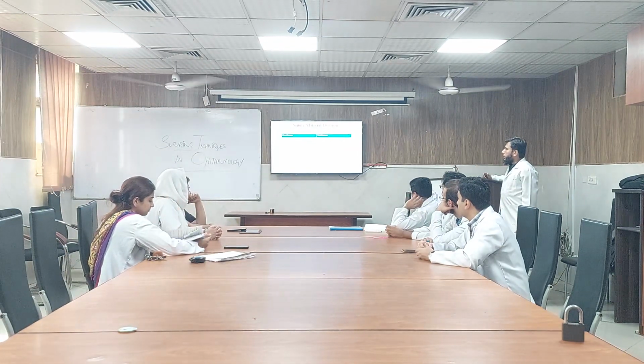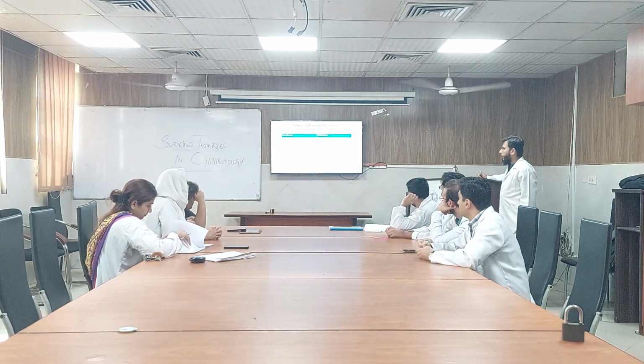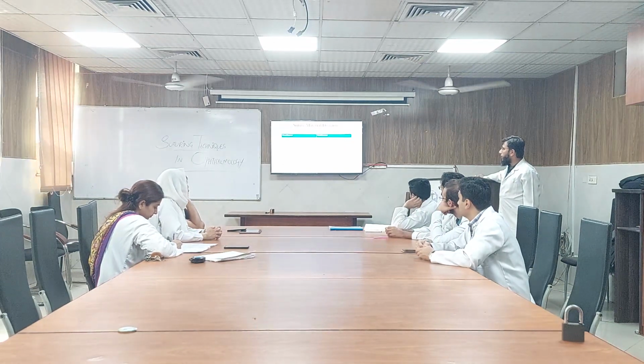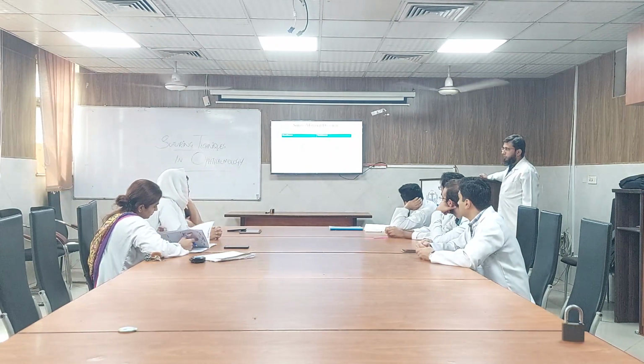Monofilament is usually slippery, stretchy, and difficult to handle. Multifilament is not elastic and is easy to handle with safe knot tying. Monofilament has stiff ends and causes irritation if the knot is not buried properly. The multifilament is usually soft, pliable, and well tolerated by the patients.